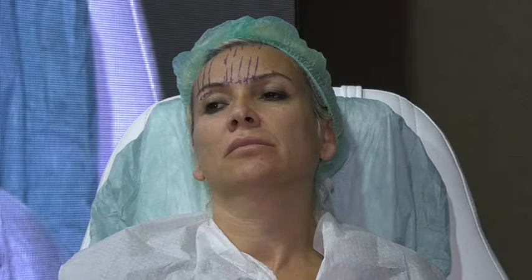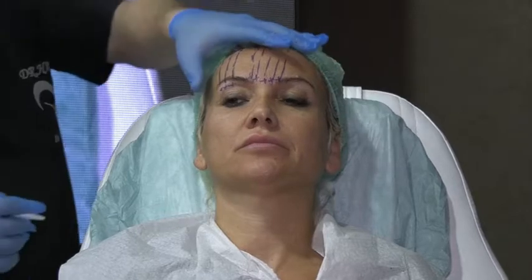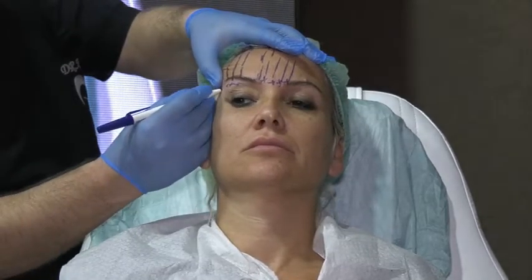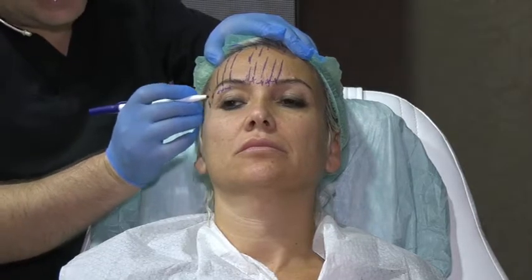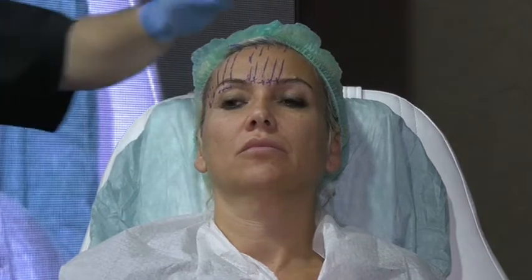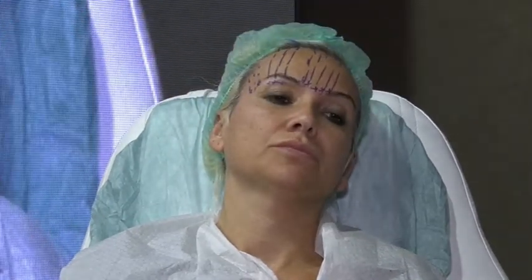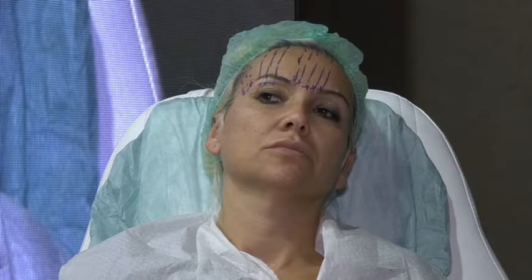Plus, you can do everywhere. For example, if she wanted more lateral, I don't mind. I can put my finger here. That's the main point. 1 centimeter medial, 1 centimeter lateral. That's my 3 threads. Okay? So, it depends on what you want. I will do what you want, not what I want.